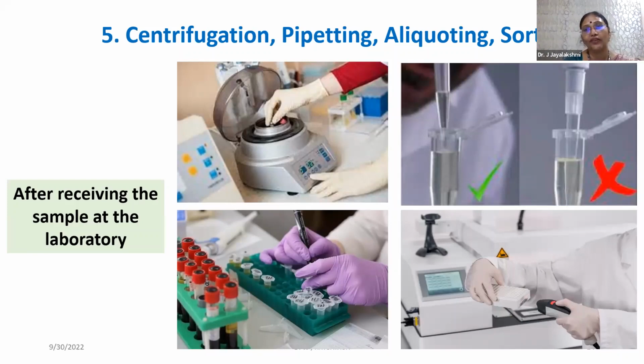So all these things are happening after you receive the sample at the laboratory, after you have accessioned the sample. Now, accessioning is one great area of control, but not used very well, I would say. Even in those labs, from my experience of assessments, you see that their acceptance and rejection criteria displayed on the board is very good, but what they're doing in accessioning is poor. There are labs where, instead of the temperature, for the last whole month, the technical staff has been writing the date. There is no temperature captured at all. They're not looking into the temperature at all.